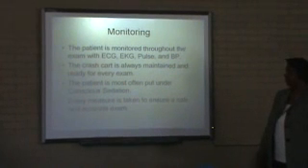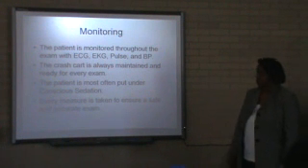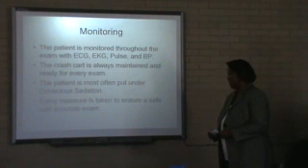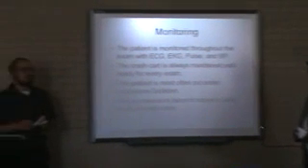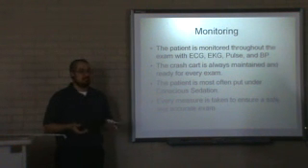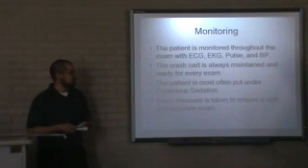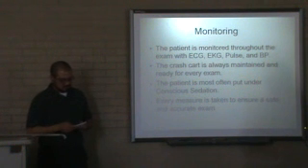Every measure is taken to ensure the patient is safe for the exam. They're put under conscious sedation so they're easily awakened. They usually fall asleep, and that's better because then you don't have them jumping around. So it's better off that they fall asleep.